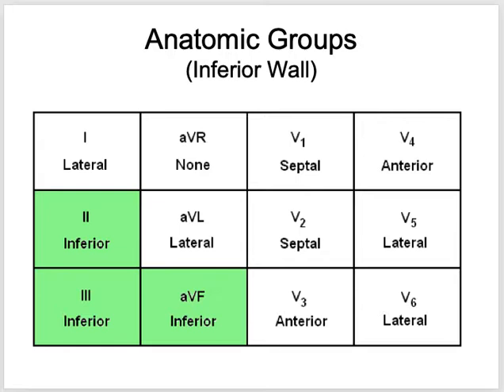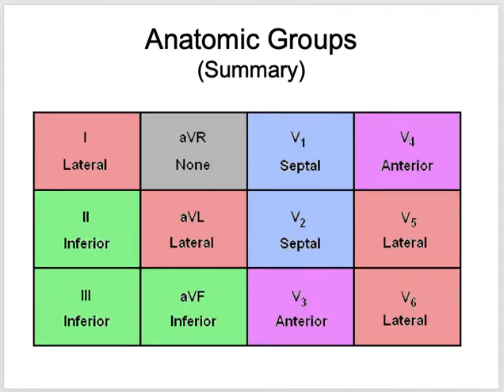They are looking at the heart from different sides. For example, in a patient who is having acute myocardial infarction, or what we call a heart attack. If you find changes in leads V1 and V2, or V1 to V4, it means it is an anteroseptal myocardial infarction.